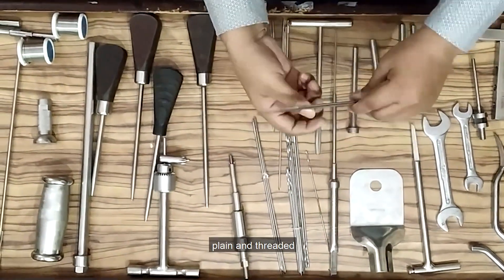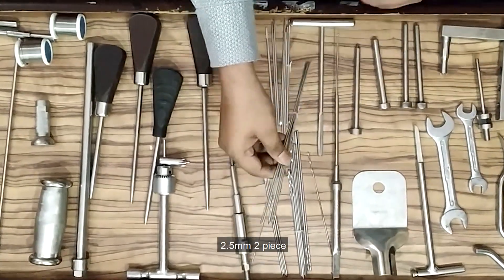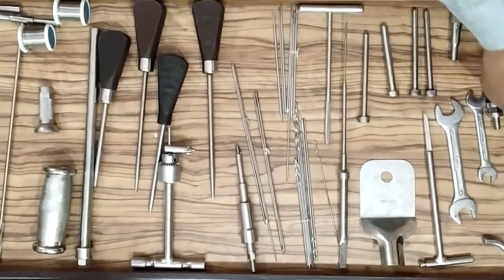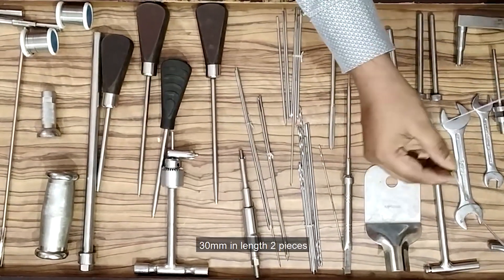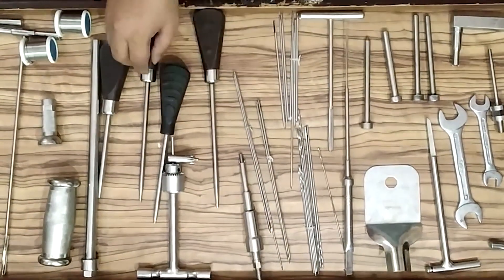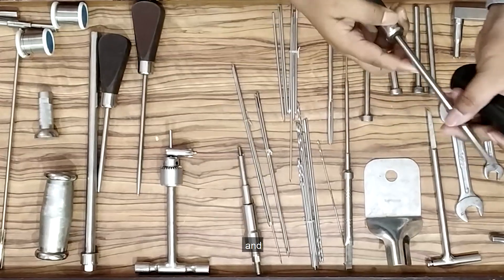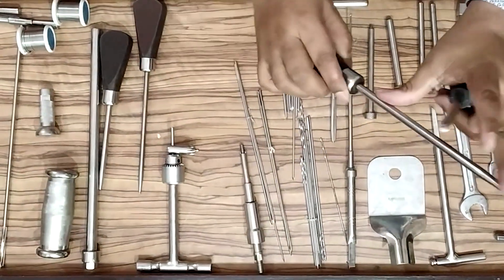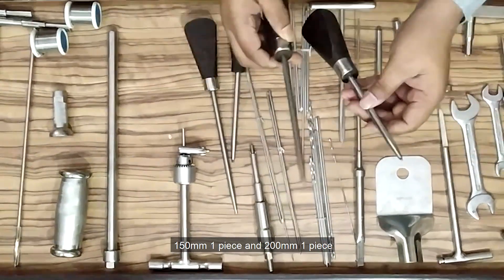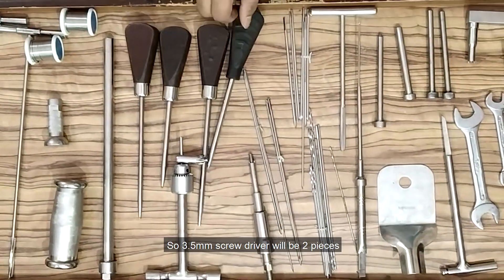Guidewire plain and threaded: 2mm two pieces, 2.5mm two pieces, both 9-inch long. Guidewire long 1.5mm, 300mm in length, two pieces. Screwdriver 4.5mm in 150mm length and 200mm length. 3.5mm screwdriver: 150mm one piece and 200mm one piece — so 3.5mm screwdrivers will be 2 pieces.